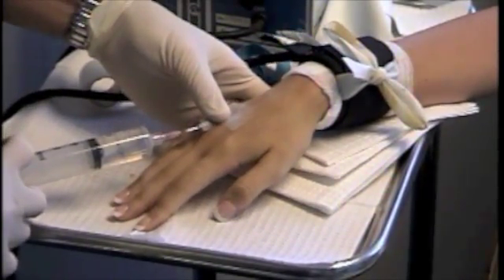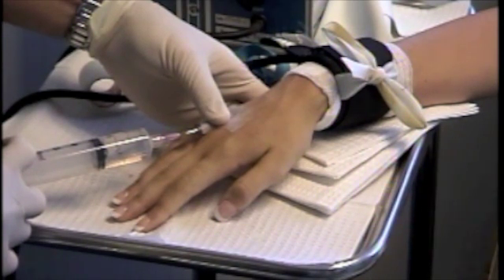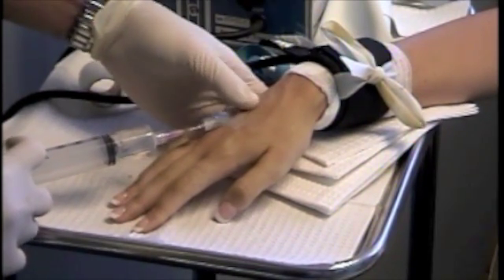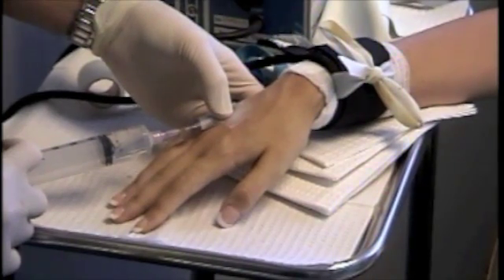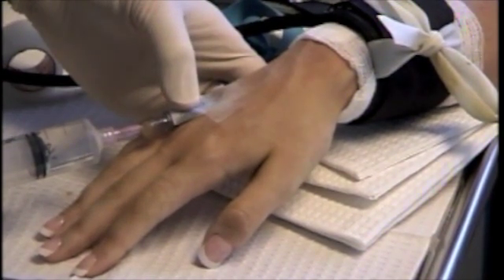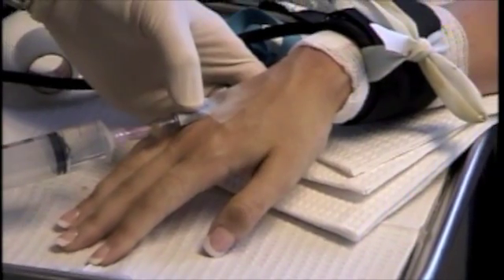The xylocaine will be filling up the veins and essentially numbing all the nerves in her hand, preventing her from feeling the injections. This is a very small amount, considering that the normal Bier block — where the whole arm would be numb — utilizes about 50 cc's of the same anesthetic solution. Again, it's half percent xylocaine without any preservative. A slow injection ensures there's no pain in the vein, since the pH balance of the xylocaine is slightly acidic and could cause some discomfort. However, using a slow injection technique, the blood vessels get numb themselves and cannot feel the injection, so a slow intravenous infusion prevents that from happening.